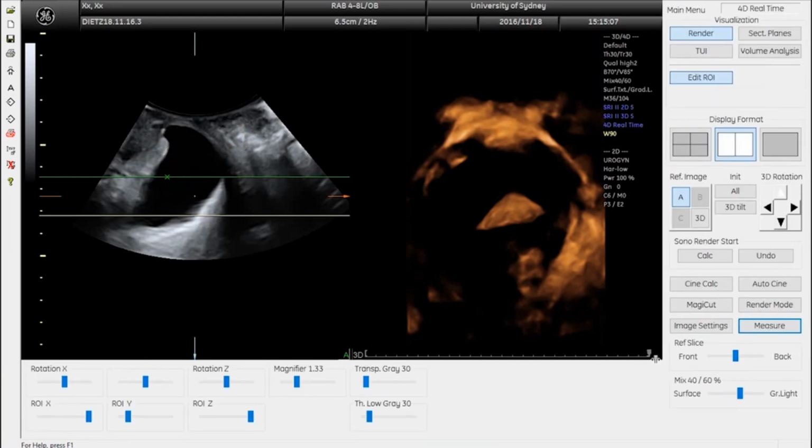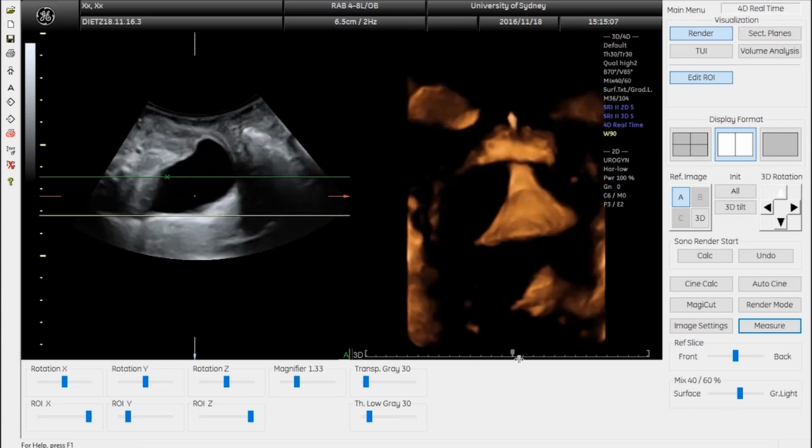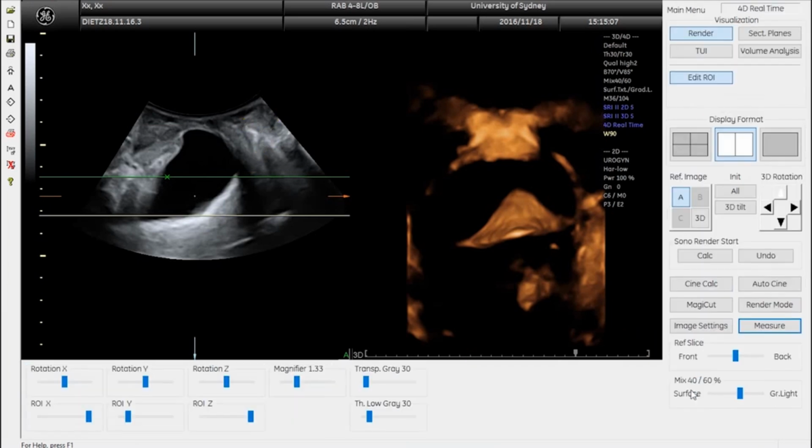The next thing to check is whether she actually does have a true rectocele, whether there is a pocket of the rectum that extends into the vagina, and for that we need to see the internal anal sphincter, which is here, and you can see that there is a distinct pocket even if it is relatively small. The way we measure that is by running a line through the internal sphincter and then measuring vertical to that. So this is a rectocele that's 11 millimeters in depth. It's tiny. This does not really matter.